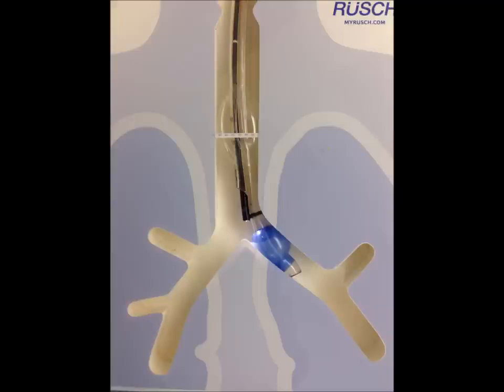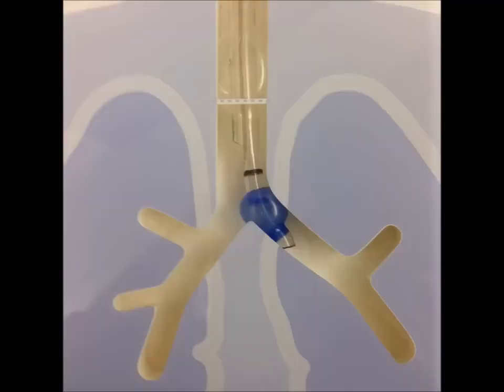So if you have to move your tube, deflate both cuffs so that you don't cause any tracheal injury, and of course you need less volume. It's a smaller tube, but this is a perfectly placed tube, and it can also be too far down. It can move, so you really need to confirm it after you move. And again, this tube has moved just a bit, and so it's now herniated above the carina, and you're not going to successfully ventilate the left side through the endobronchial port. The right side will receive some ventilation.